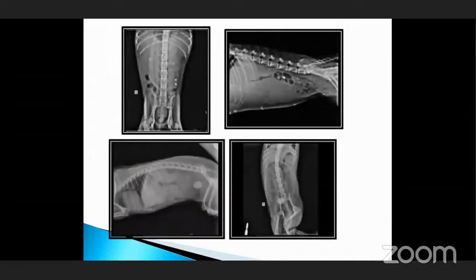Next, in the first radiograph, that is the VD radiograph, you may see small nodular radio opacities. You may say these are foreign bodies, metallic bodies, or bony pieces, but in the later radiograph, you can well appreciate these were the teats of the dog, which were seen as radio opacities in the VD view.